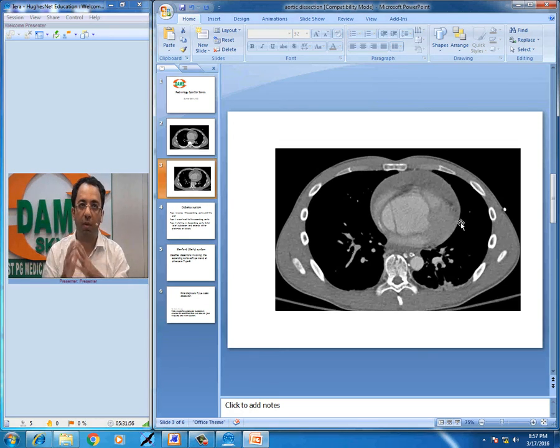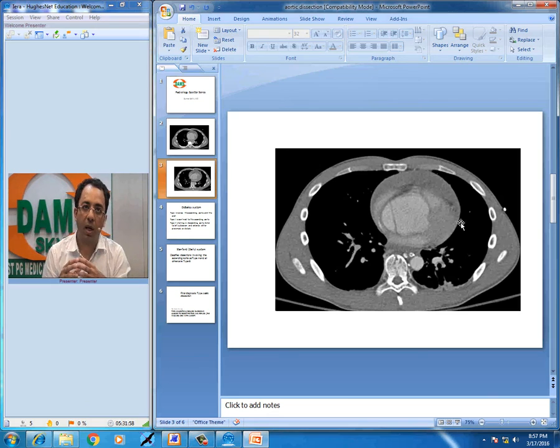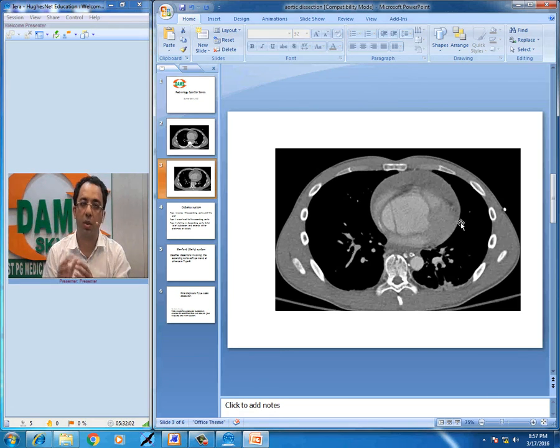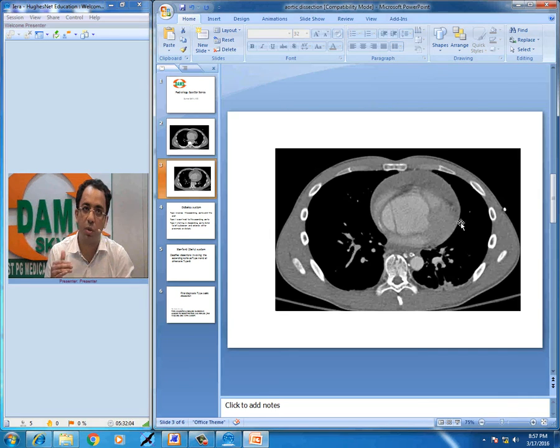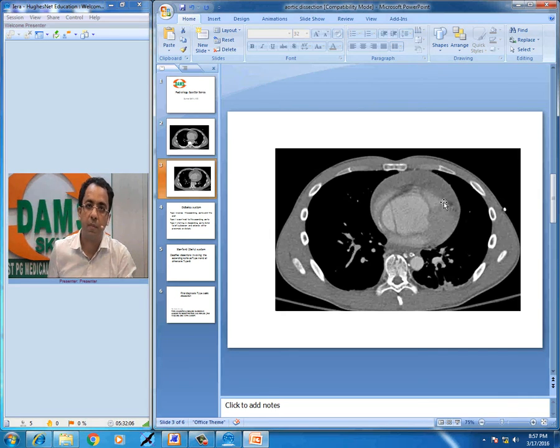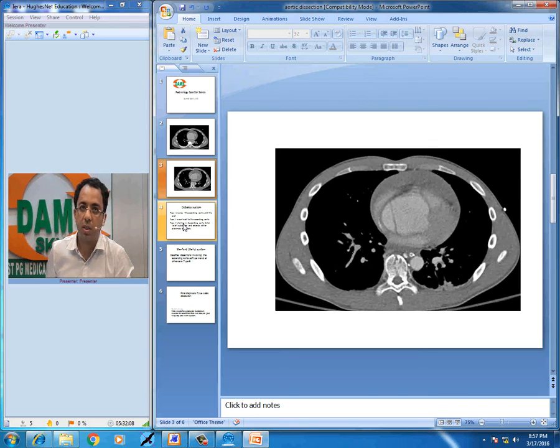So what should be the final diagnosis? We are looking at a patient with ascending aortic dissection with associated cardiac tamponade — that was probably the reason he was brought to the emergency.